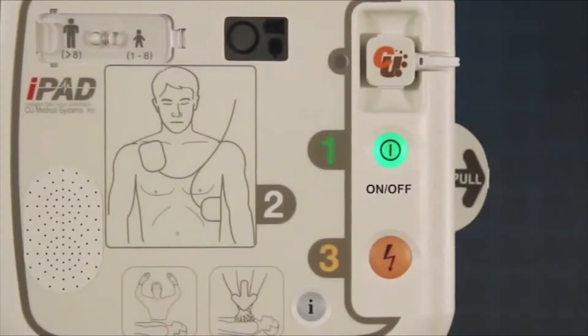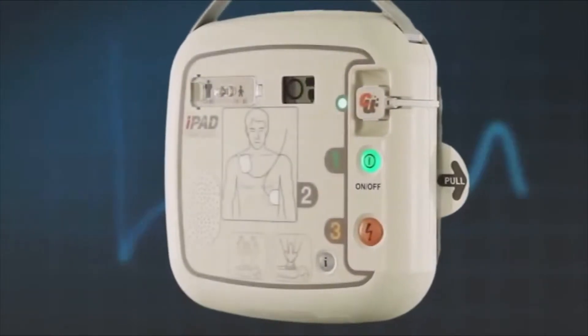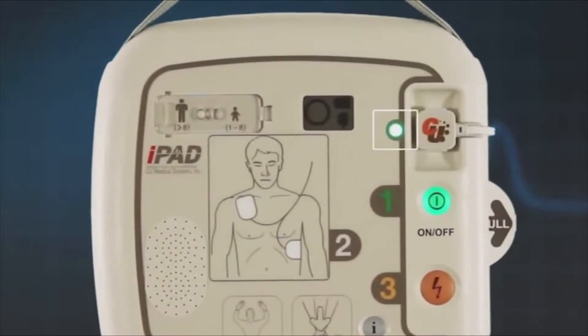To use the AED, first press the green on button. A green light next to the pads connector will illuminate to show if the electro pads are properly connected. If that light is flashing, please check that the pads are correctly connected to the unit. If the light is constantly lit, the pad connection is good.